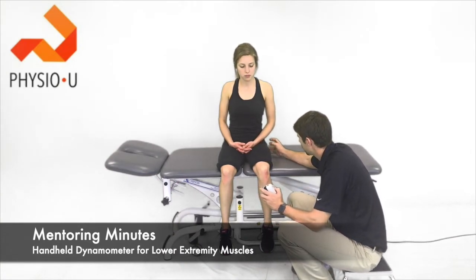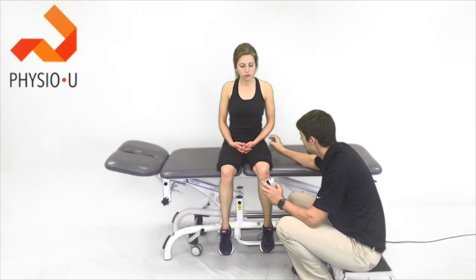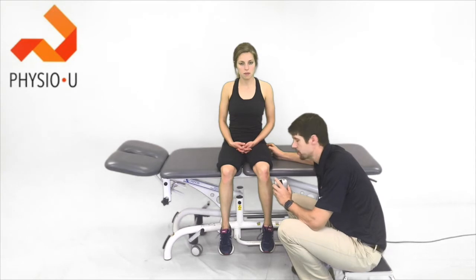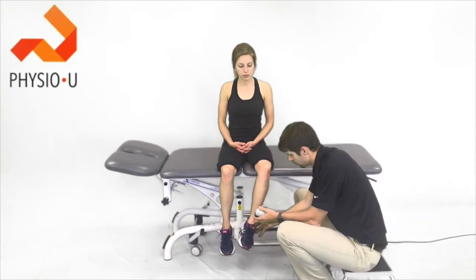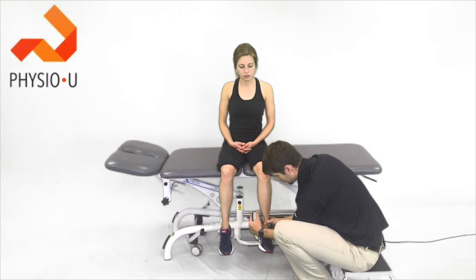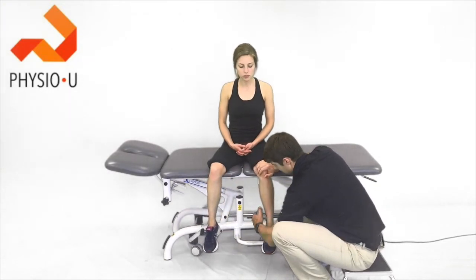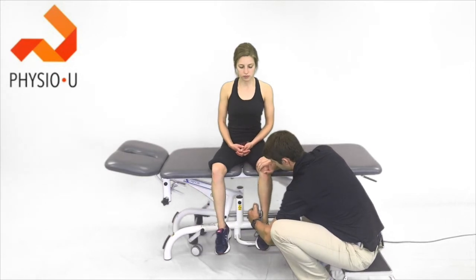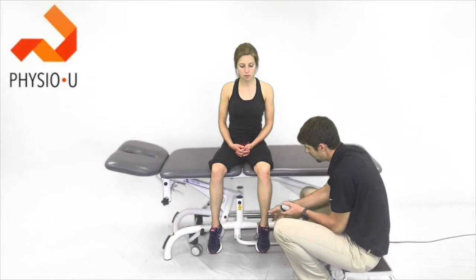For quads, we can also use the handheld dynamometer for patients with hip pain or knee arthritis. There are a lot of good studies looking at hip strengthening for those pathologies. If we're looking at the external rotators, we're going to place the dynamometer just proximal to the medial malleolus, stabilize at the knee, and have the patient pull their foot across — pull, pull, pull, pull — and relax.